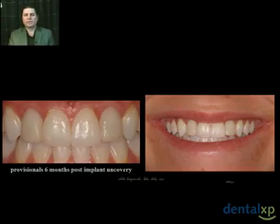One of the biggest advantages with screw-retained provisionals for Jenna is that the possibility of a problem occurring while she's away from Denver is much lower. And also there's no cement to be concerned with. There's no excess cement to worry about a possible soft tissue infection or complication.